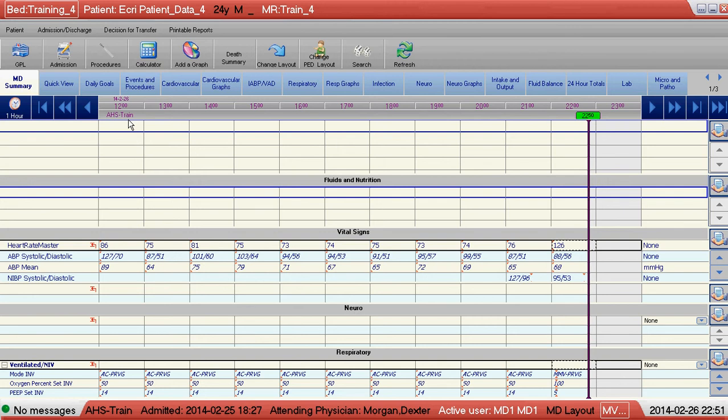Over the course of the rollout of eCritical across the province, there have been incremental improvements in the system that weren't necessarily present from the very beginning. This is, again, one of the more powerful and best features about eCritical: it is a constantly evolving process. For some users, they would say it's not meeting their needs, but with good quality feedback, changes are happening.